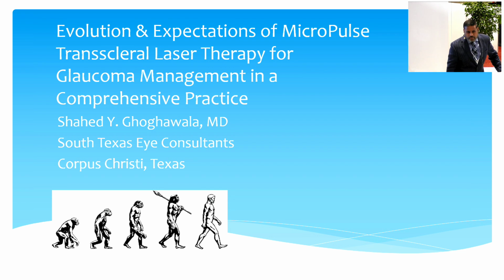I have a question. You talked about the enhancement at 3 months. Do you have any experience or any view on repeat procedures after a more extended period if pressures start to rise? String together multiple treatments? Yes, there's definitely many glaucoma surgeons who do this procedure not just twice, but maybe 3 times or 4 times over the course of a year. And if you're seeing incremental improvement, you can continue to use it and feel that it's going to be a safe procedure for them, because I don't think there's an additional risk of irritation, inflammation, uveitis, and CME like you might have if it was the classical continuous wave CPC.